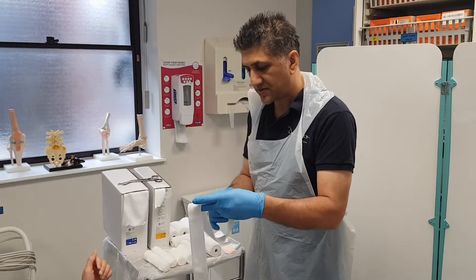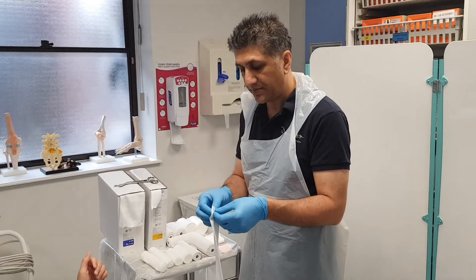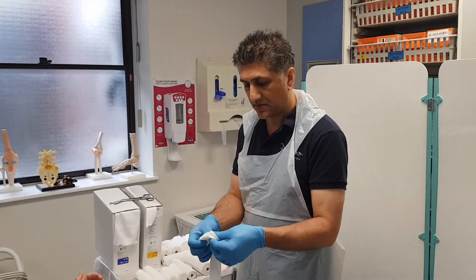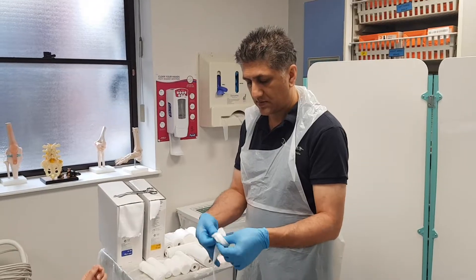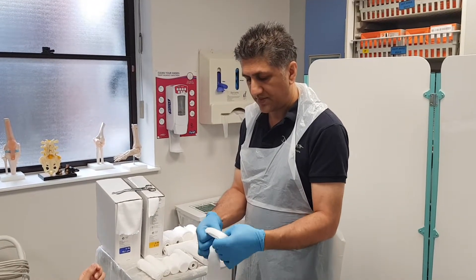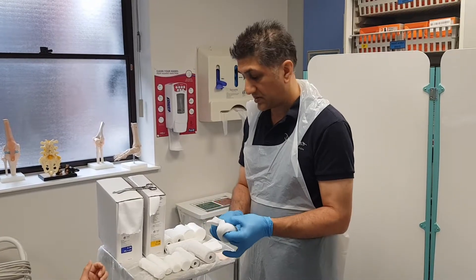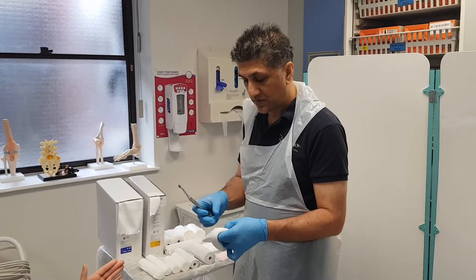If the patient's got a broken arm it's going to be painful to apply this, so if we roll it up like a stocking or a sock, we should then be able to unroll it onto the arm. I'm going to make a little nick in it for the thumb.